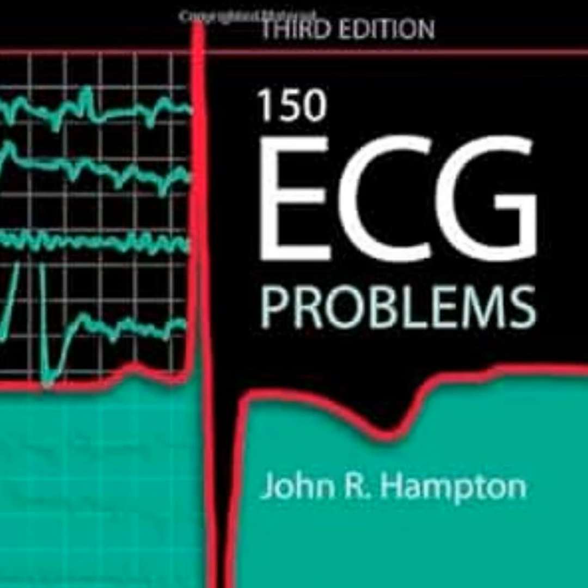Right. And Dr. Hampton also applies this exact same logic to heart failure. Oh. Yeah. He notes that while an ECG can show you signs of prior insults, like, say, pathological Q waves from an old infarct, it cannot definitively prove mechanical failure. Because it's just electricity. Exactly. It's primarily a tool for ruling out pathology in this context. If the ECG is completely normal, then significant heart failure is highly unlikely. But an abnormal ECG doesn't just automatically confirm it. Because, again, it measures electricity, not ejection fraction.